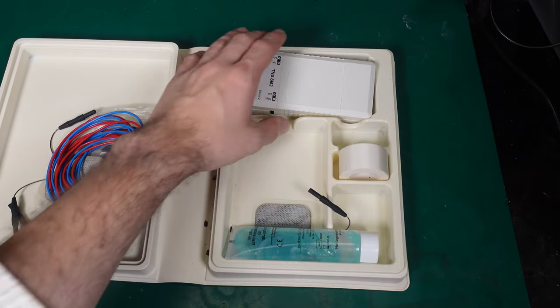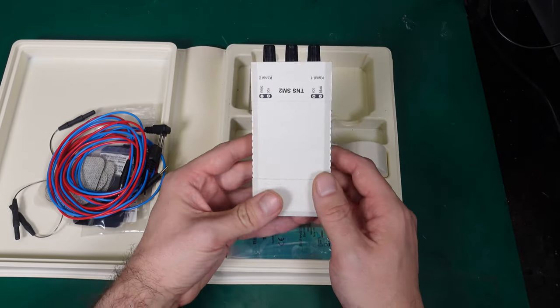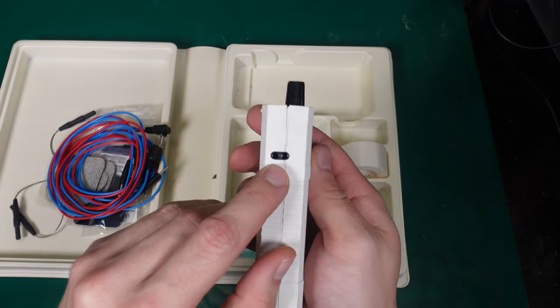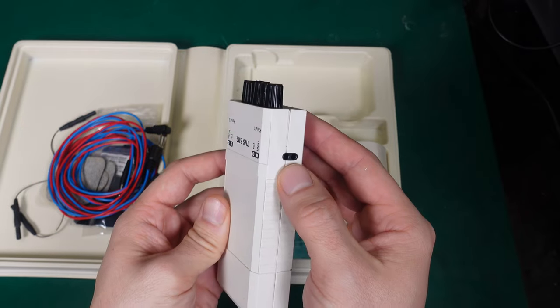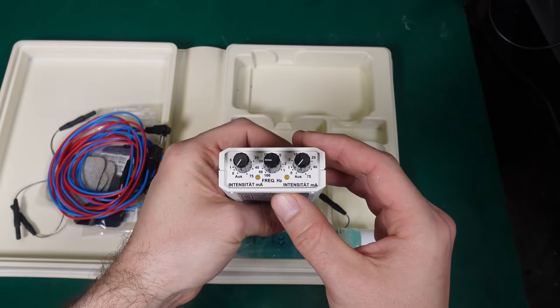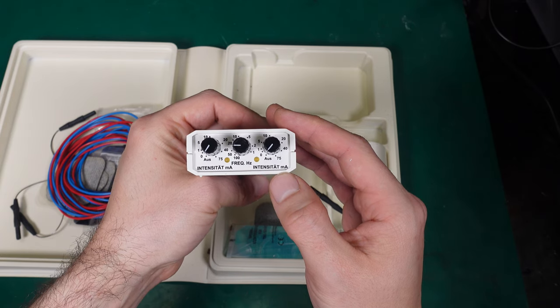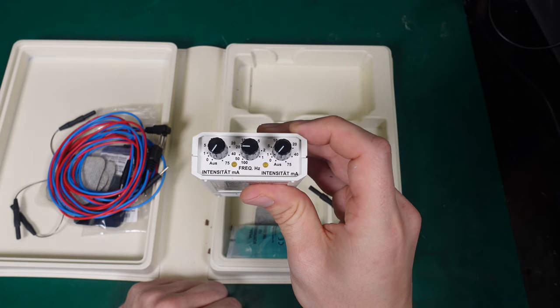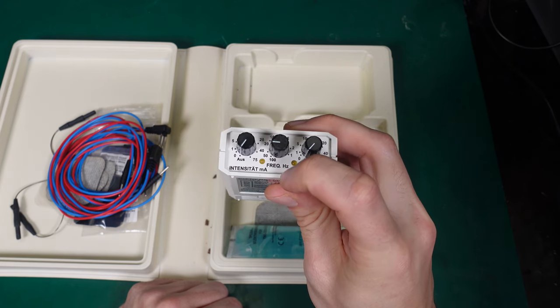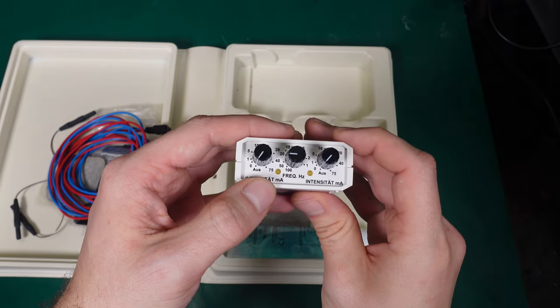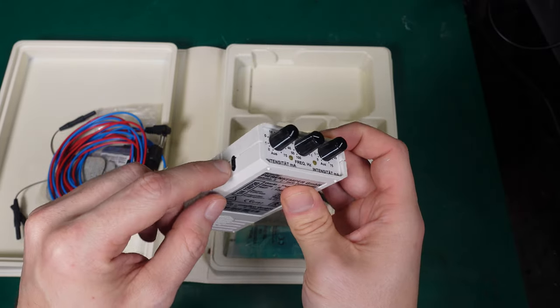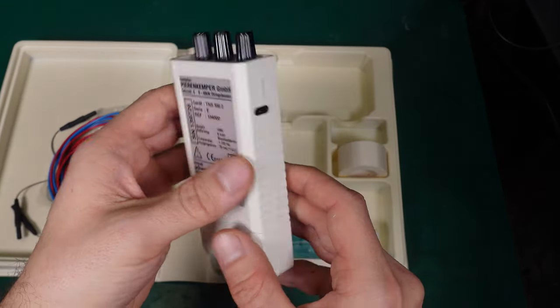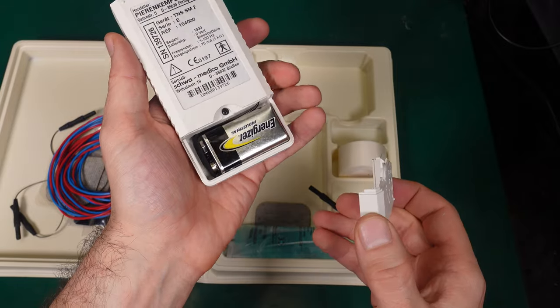This is the unit itself, so we've got two channels. We've got the adjustment, we can see we've got the milliamp intensity and it can go as high as 75 milliamps. We've got the frequency and the same adjustment for the another channel. It's powered from a 9-volt battery.